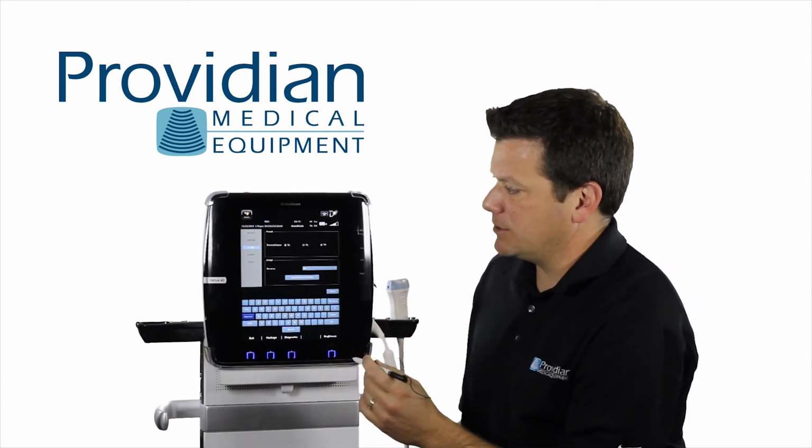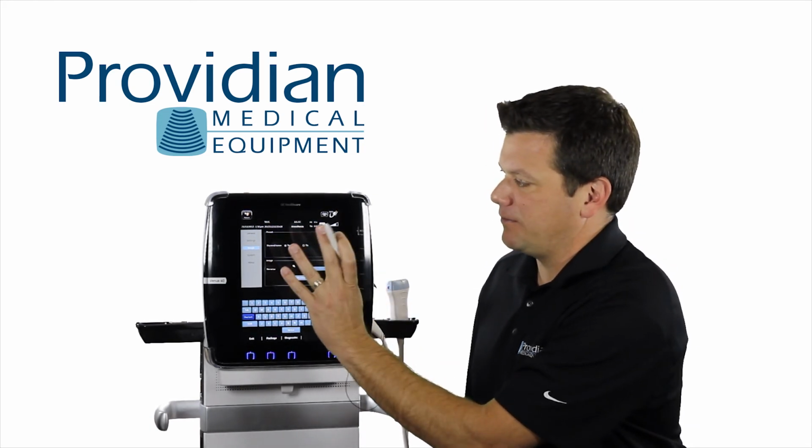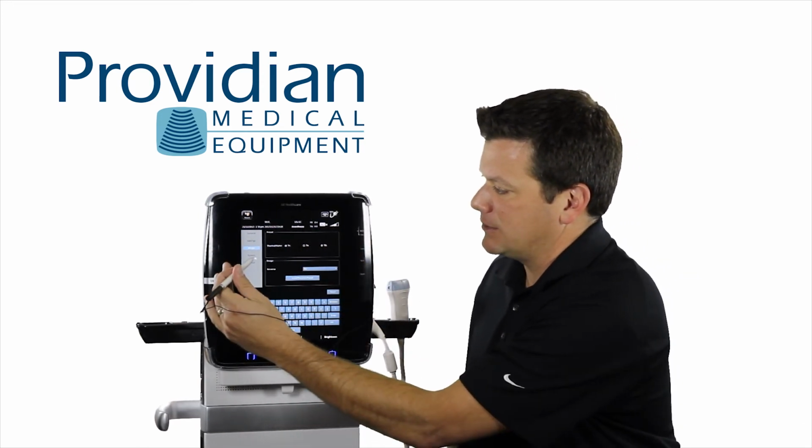We click on image, and this shows what do you want up here. Would you like to reverse the image so it flips so that GE logo's on the other side? And what type of indexes would you like to show up on the thermal side?